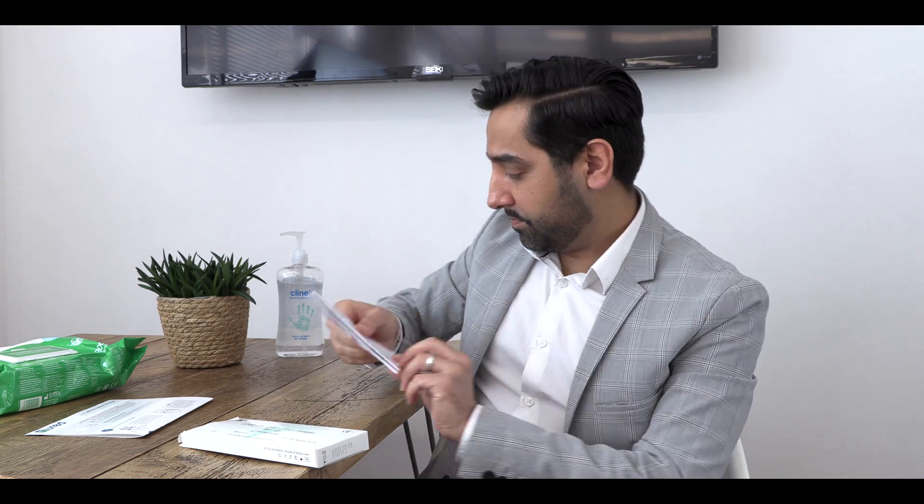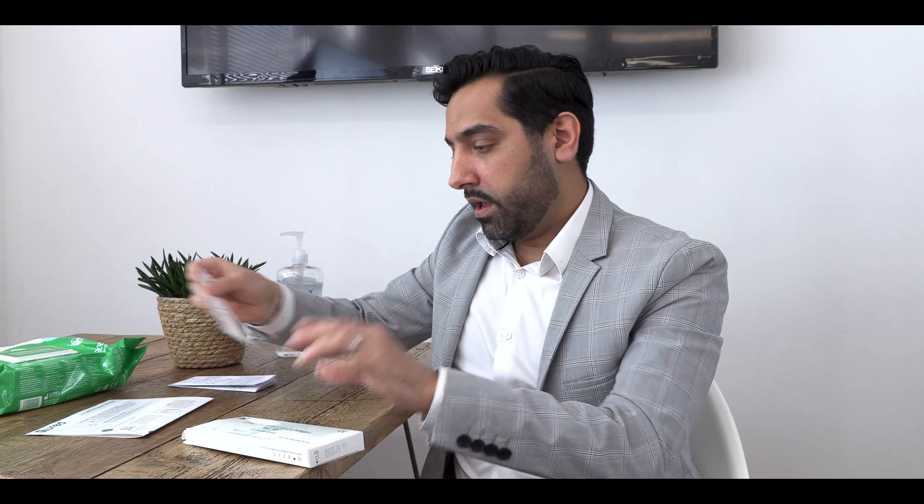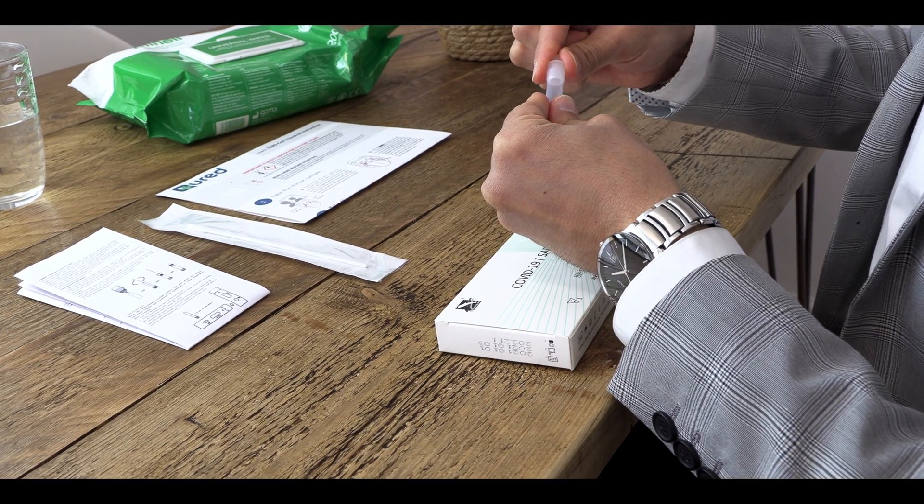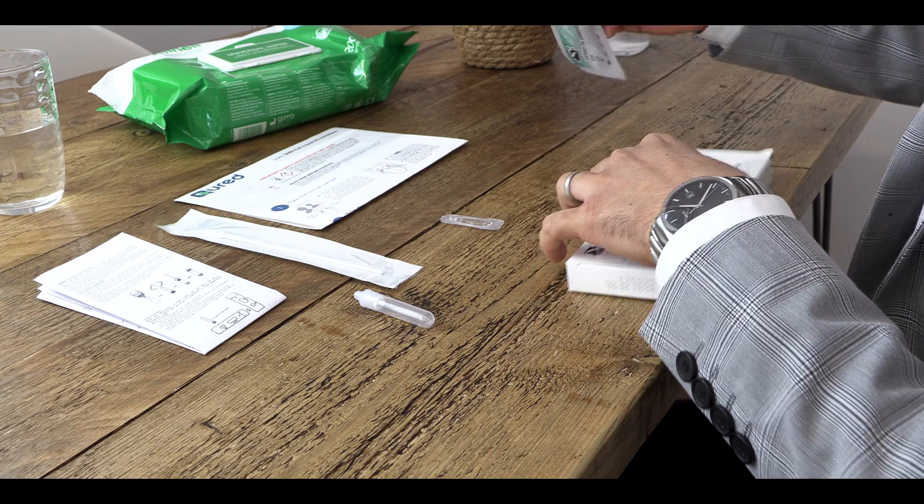So firstly, let's go through what you can expect to find in your test kit box: instructions for how to do the test; a sterile swab that is sealed, which will be used to extract the sample from the back of your throat and your nose; an extraction tube with the dropper on top; a foil pouch containing the test cassette; and buffer solution.